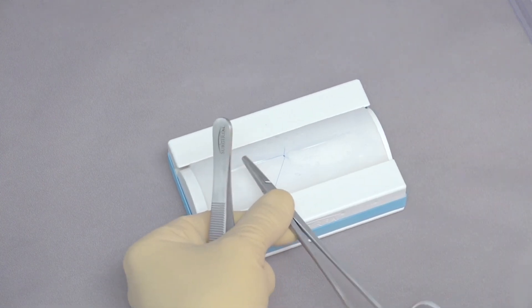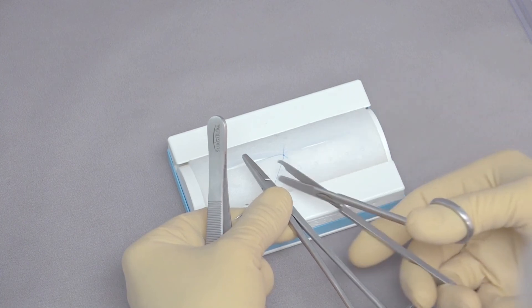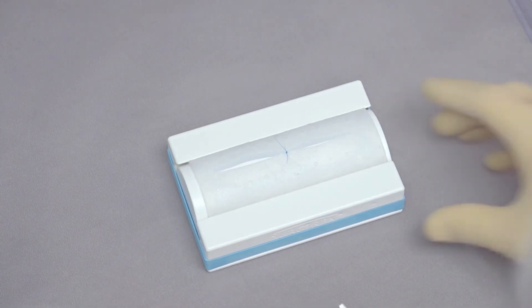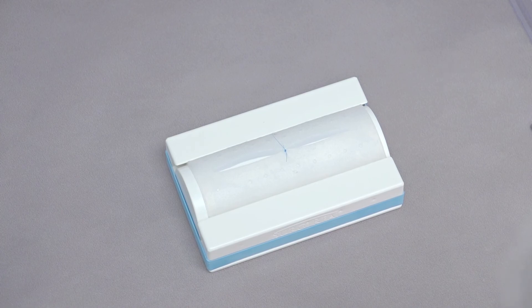Because this is representing a skin suture, we can leave the ends about a centimeter long. If we were doing a buried suture, we would leave them about two millimeters long.